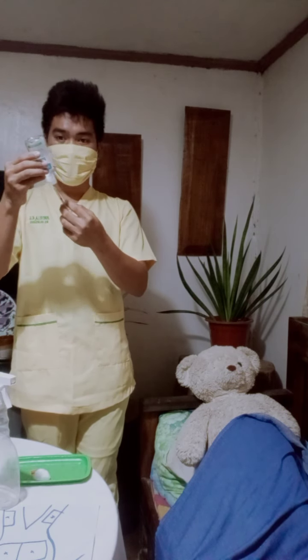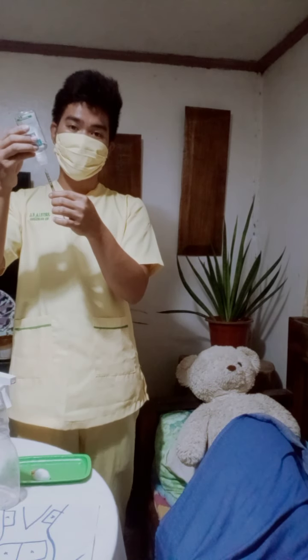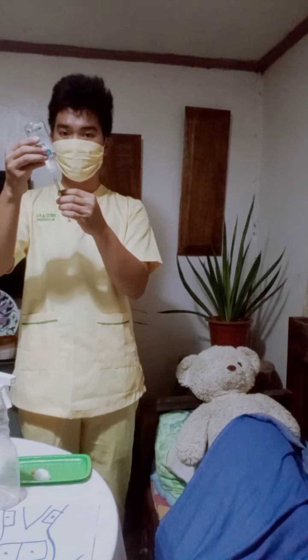So without touching the inner plunger, to avoid contamination, of course, we need to do it accurately. After that, we're going to check for the presence of air inside the needle, inside the syringe. If there is air inside the syringe, we're going to draw it back and then repeat. We're going to get again the desired dose that we need.